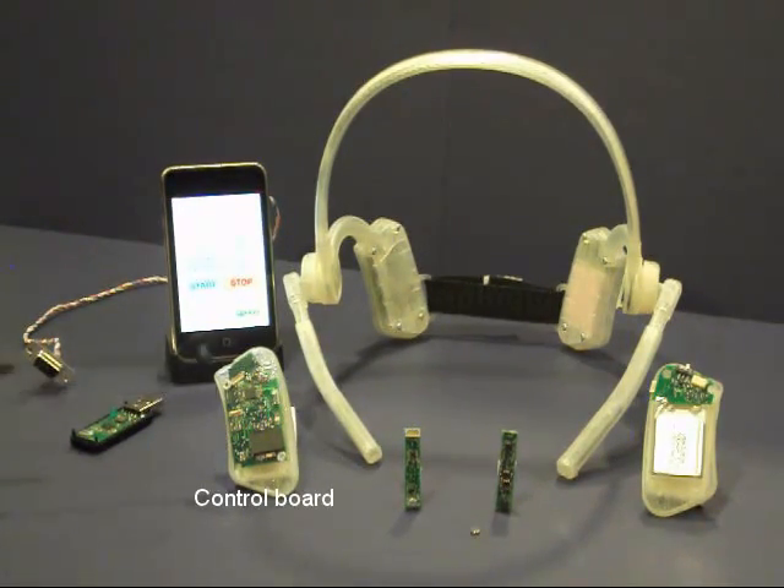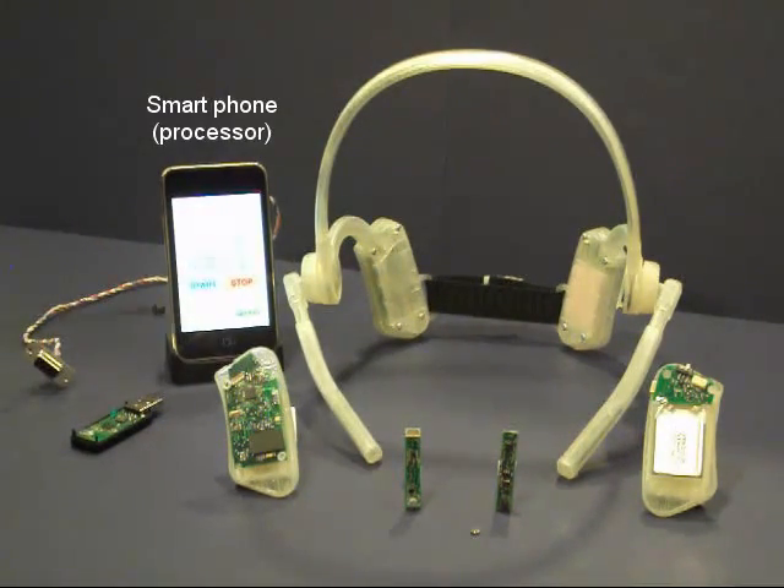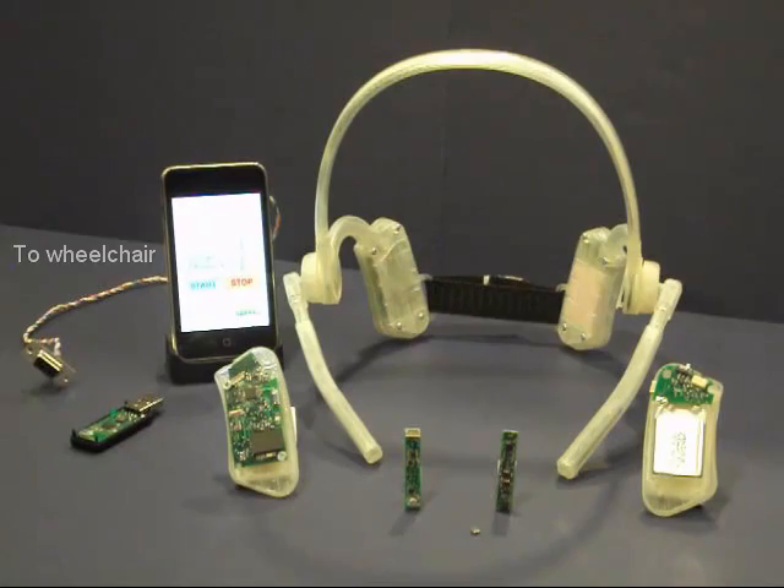A control unit collects sensor outputs and then wirelessly transmits them to a smartphone. The smartphone then translates sensor outputs into control commands to operate different devices in the user's environment, such as a wheelchair or a computer.